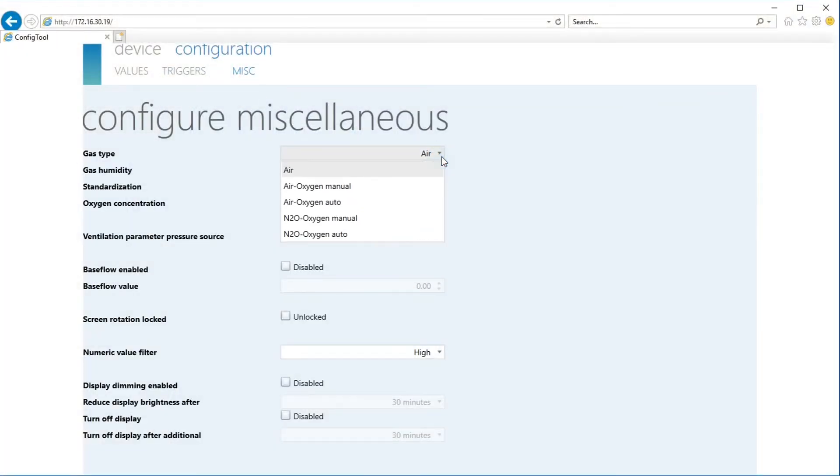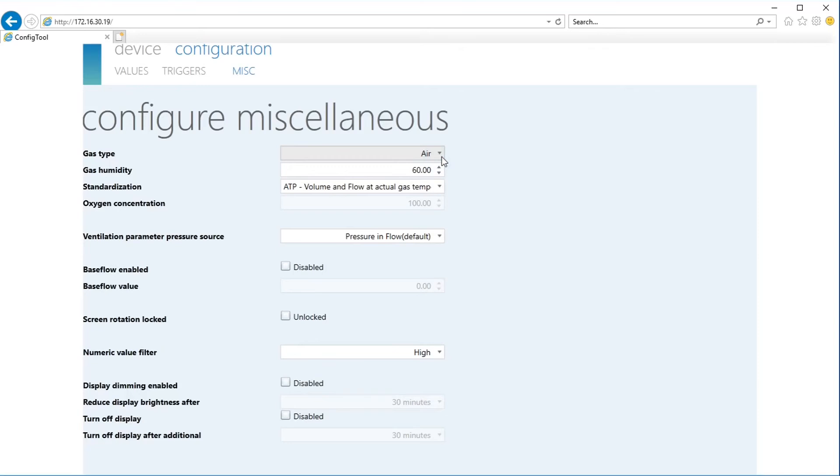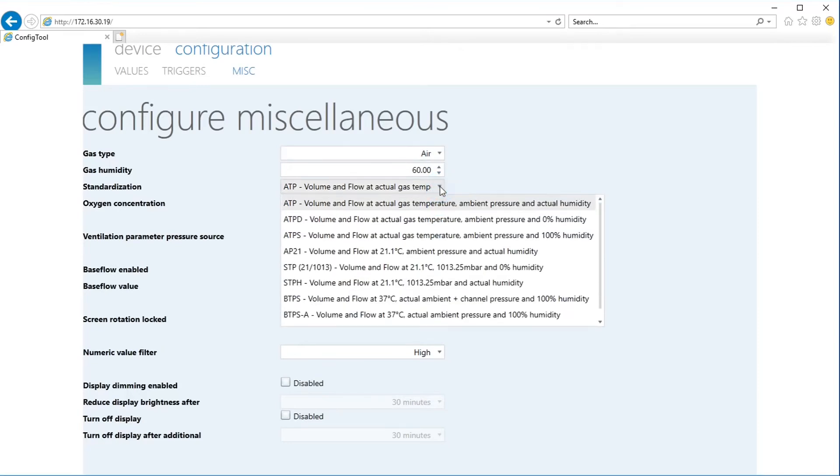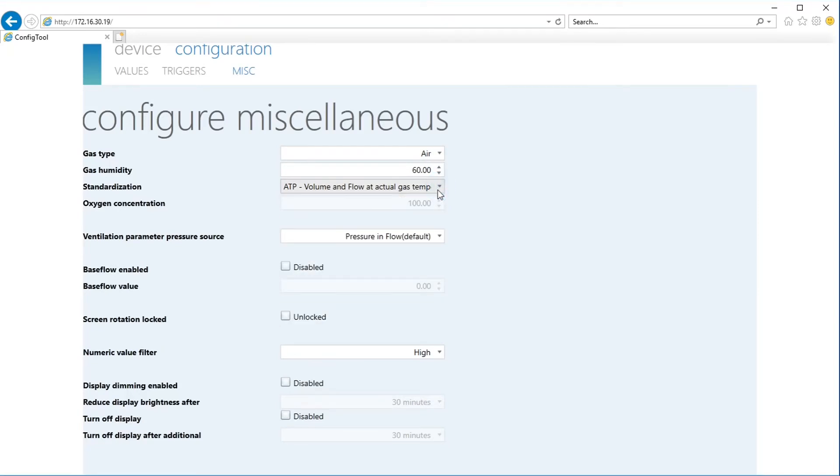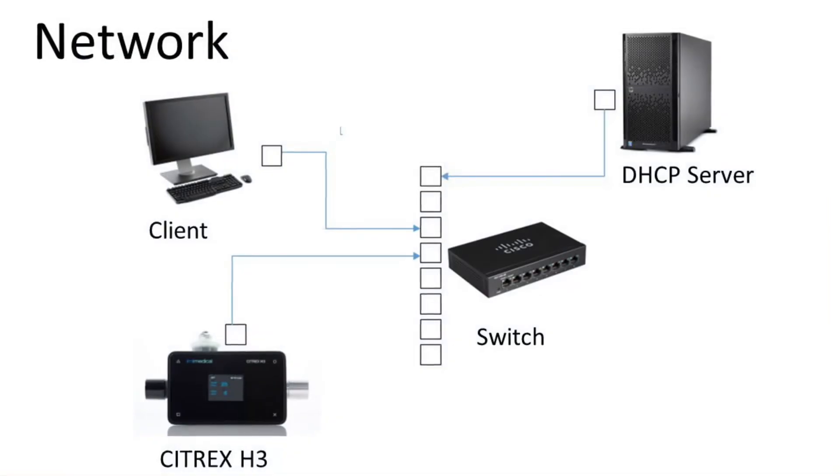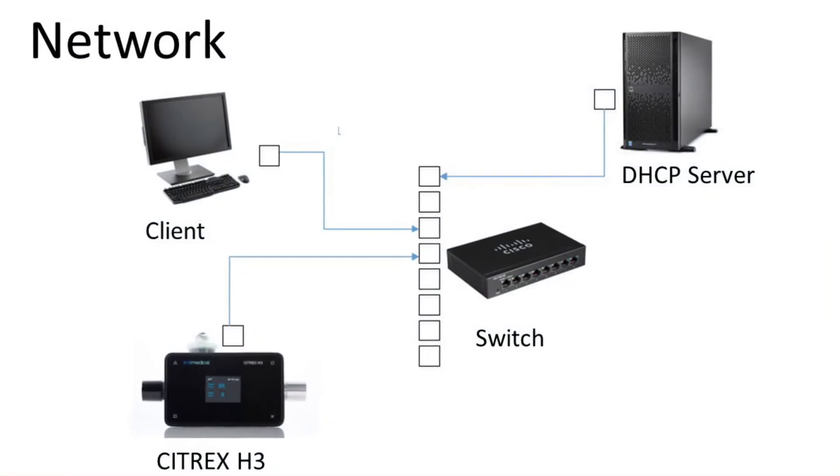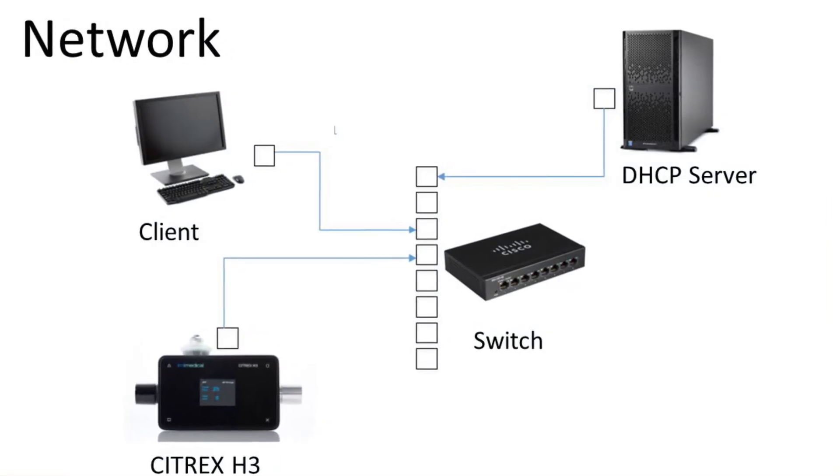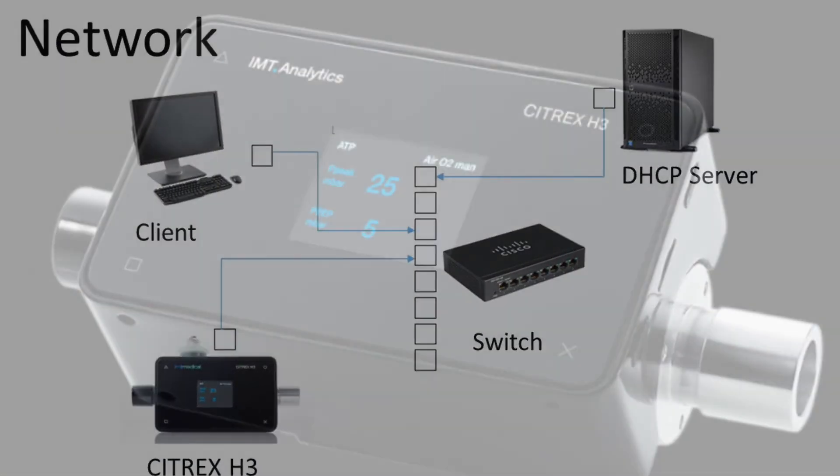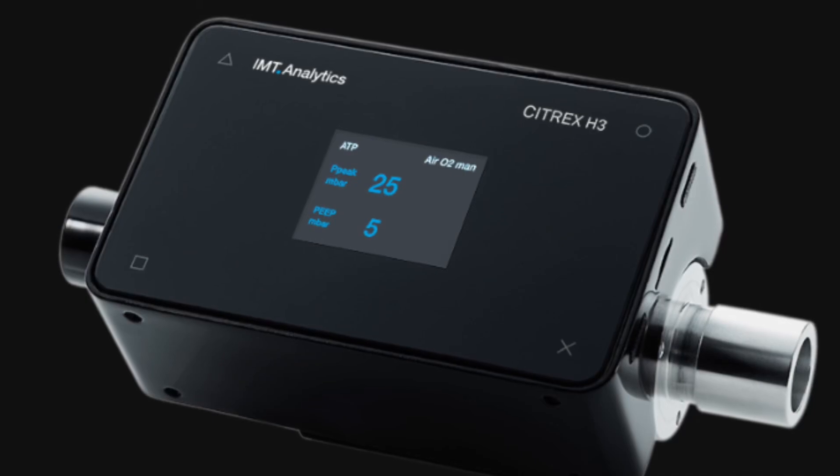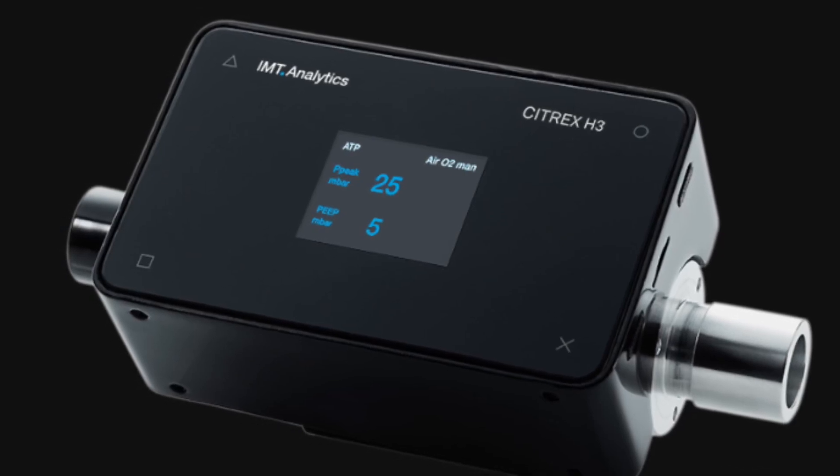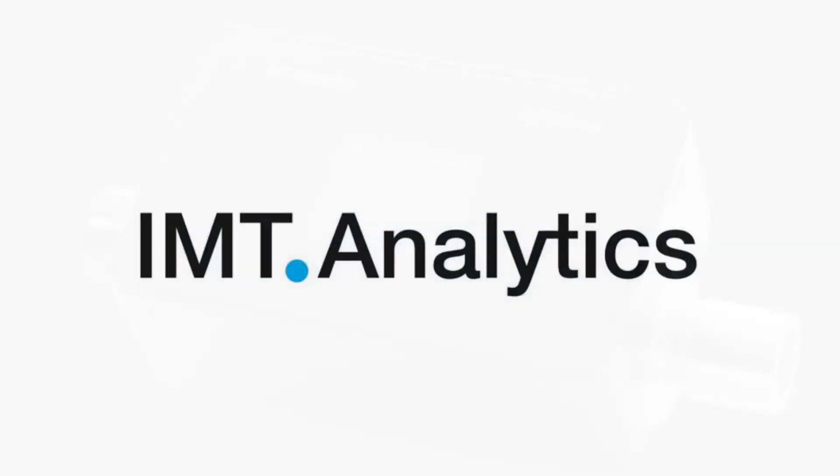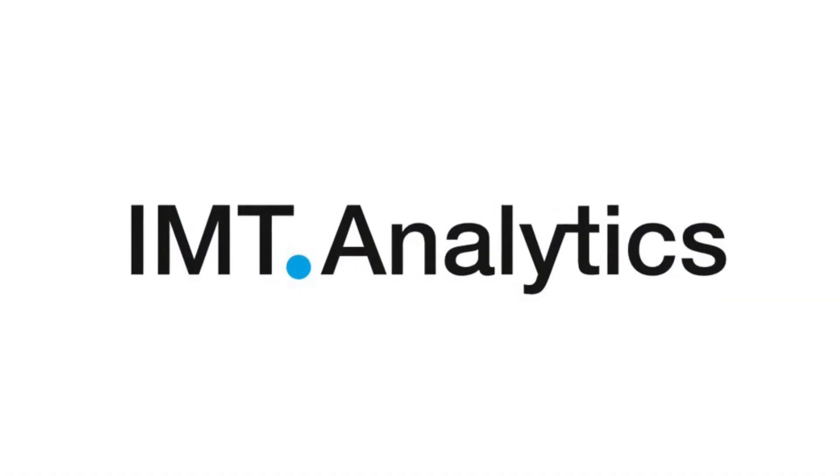What's also interesting, you can select here the gas type and gas standard. But also, to save battery time, you can dim the display or switch off the display. So it's very easy to use the internal web server of the Citrix H3 to configure the whole device.